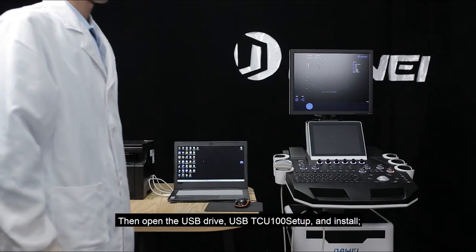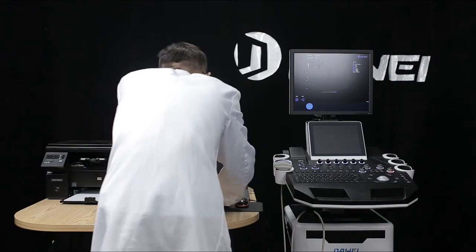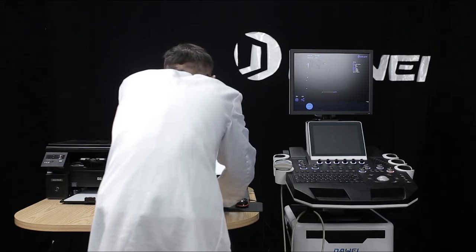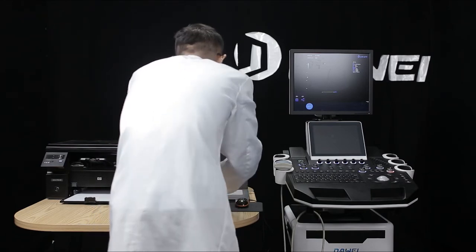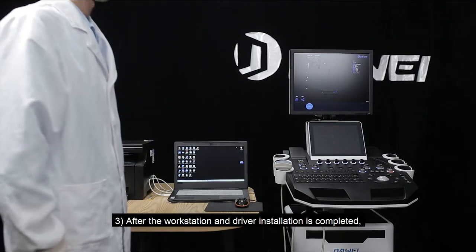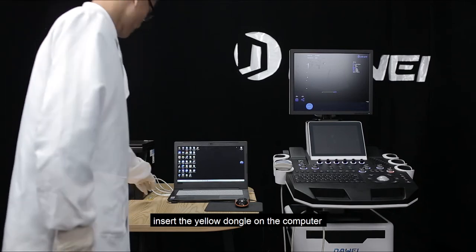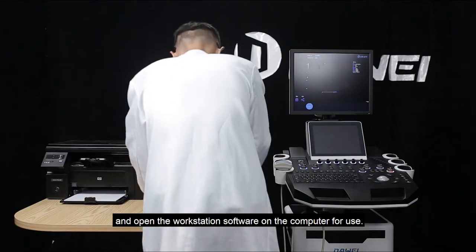Open the USB drive and install. After the workstation and driver installation is completed, insert the yellow dongle on the computer and open the workstation software on the computer for use.